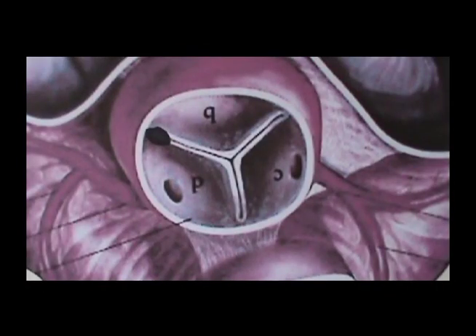Color flow Doppler is very helpful in locating flow disturbances. Color flow Doppler is a two-dimensional function, as represented by this red laser line. With color flow, you must fan or angle across the entire valve to find small lesions.